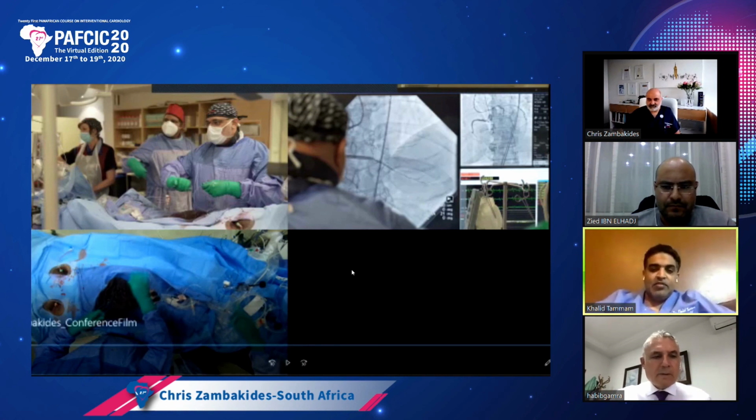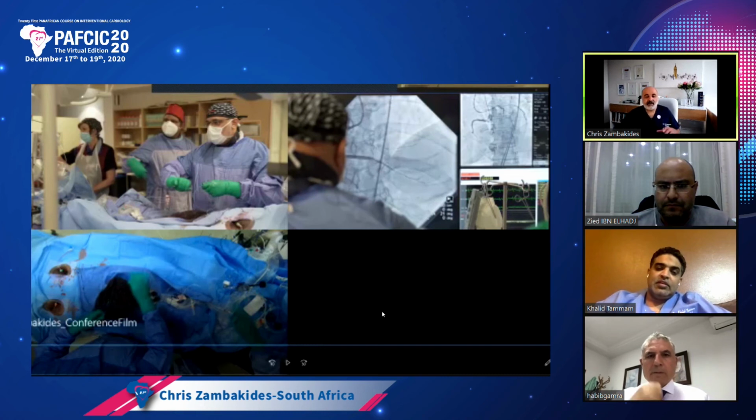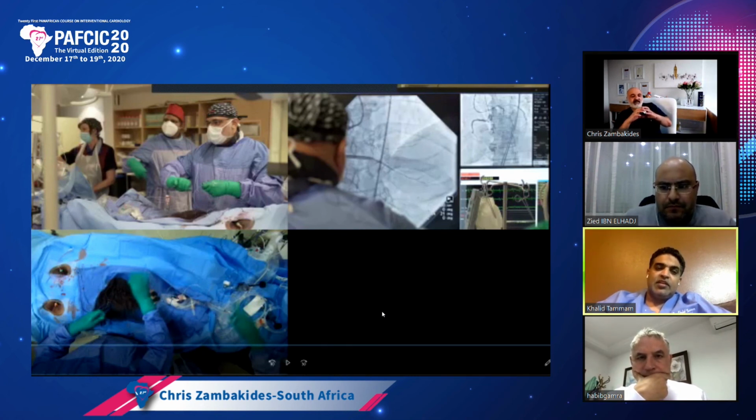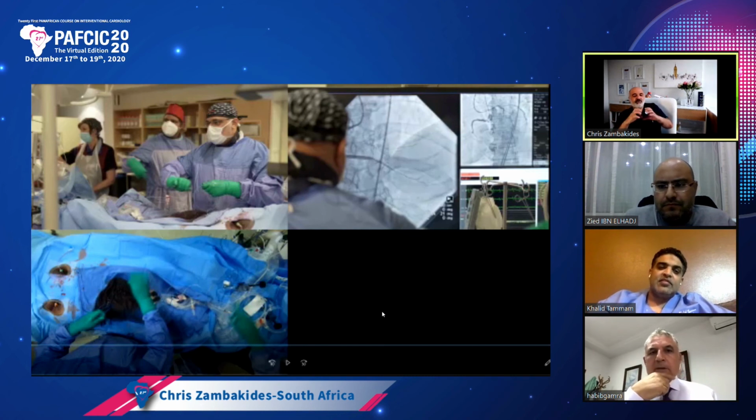But let me ask you a question, because we don't follow you about the reverse cart. Where is the part you did the reverse cart in this case, or you went intima to intima? So in this case, we were lucky in that both the antegrade and retrograde wire went inside the stent. So we know that kissing wire technique, yes? Yes, so essentially we knew that inside the stent we're in the same space, so we brought the guide extension into the stent, and then we were able to get into the guide extension.